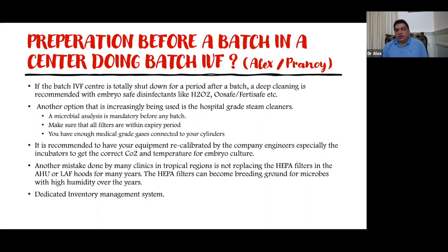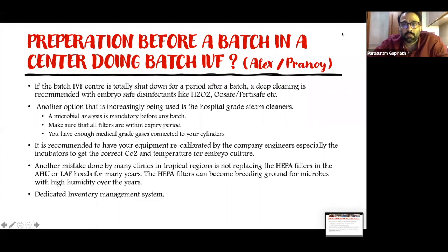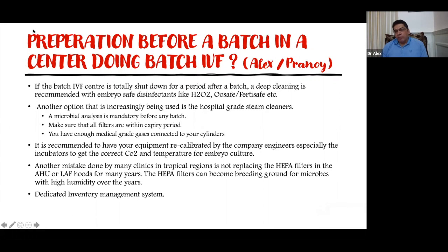And second, most important, I think foremost important thing that I've seen in many of the batch centers in India is the type of gases, because there is no medical grading for the gases in India. So most of the problems that you find in pre-implantation embryo quality and early miscarriages can be due to the gases that you are using. So you have to be very careful about what kind of gases you are getting for your incubators. I think these are the important things that you have to keep in mind.